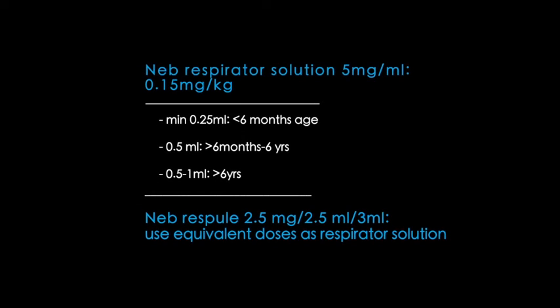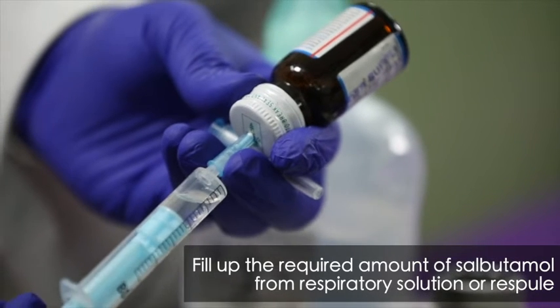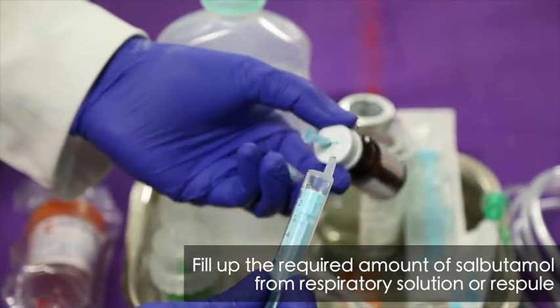The nebulizer respirator solution contains 5 mg of salbutamol per ml. The dosage for administration is 0.15 mg per kg. Taking age into consideration, the administered dosage varies as shown on the screen. For neb respule, use equivalent doses as respirator solution. Fill up the required amount of salbutamol from respirator solution or respule.